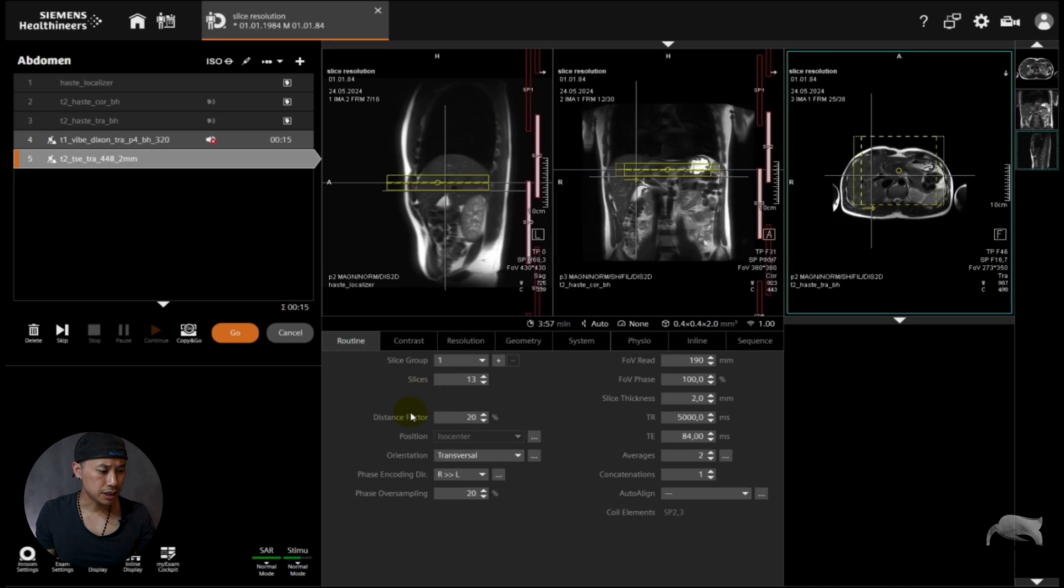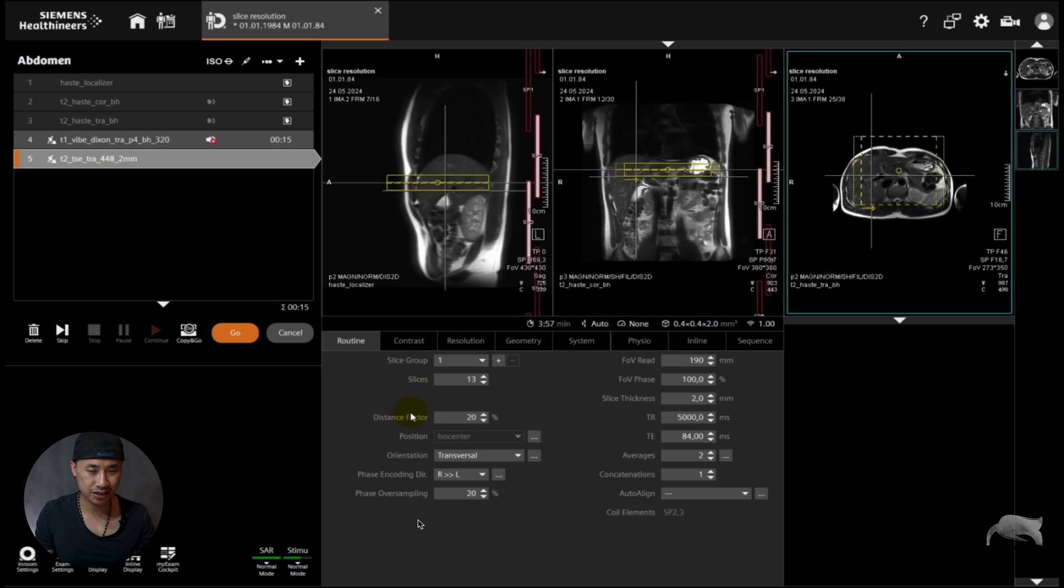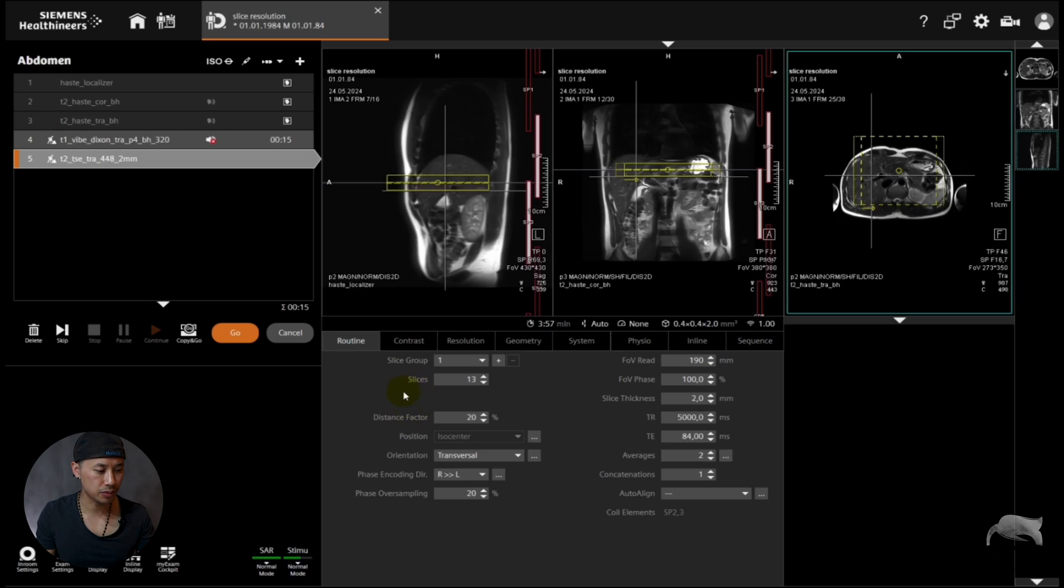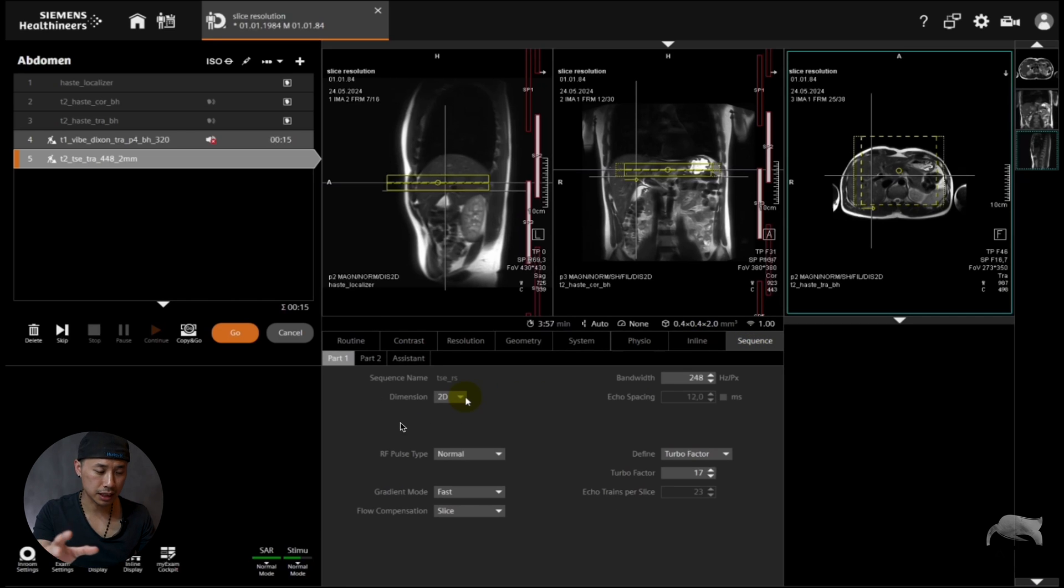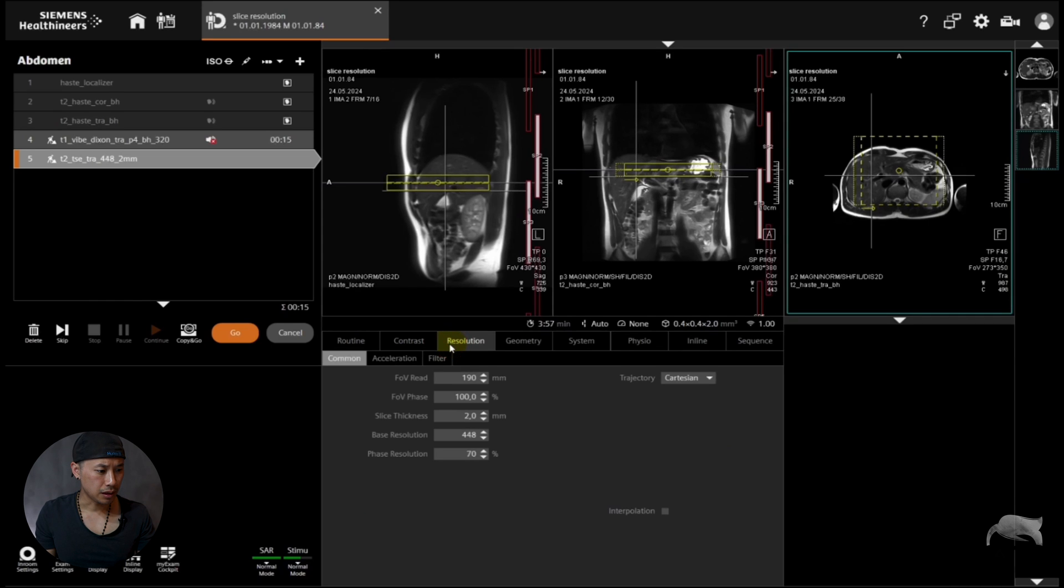So you see there is no slices per slab like you saw in the 3D. There's no slice oversampling just like I told you on 2D. It's not available like that. And you go to sequence, it says the dimension is 2D, then you know it's a 2D.